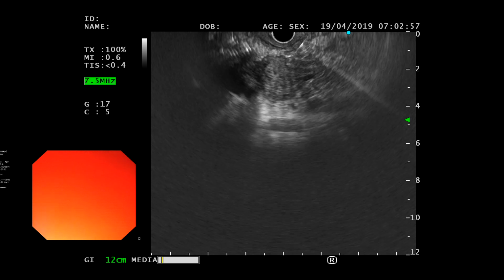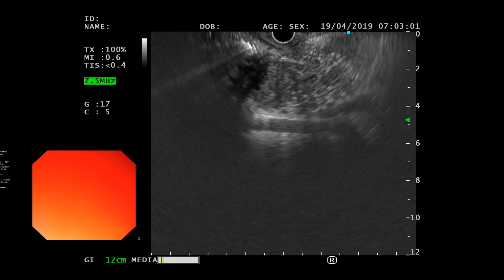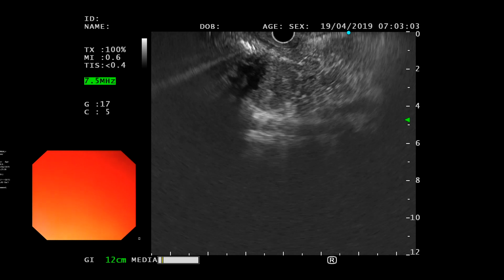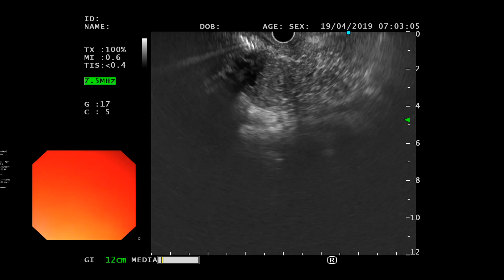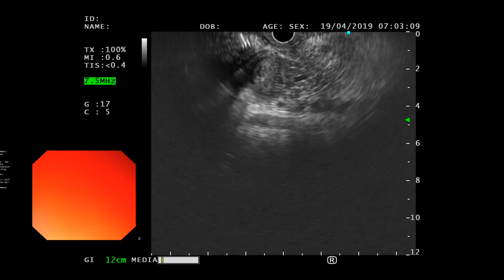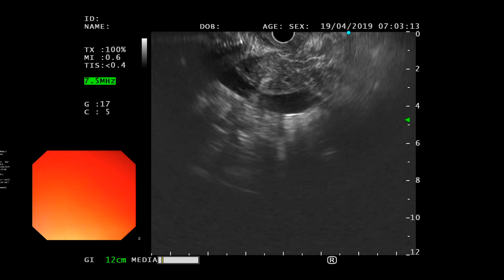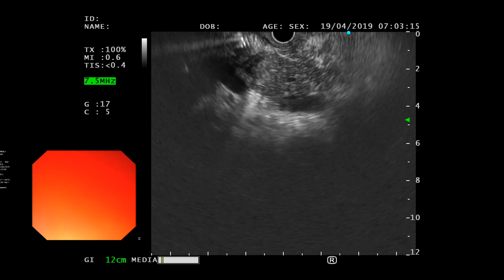This is the last pass. हमेशा इसको लॉक करके निकालो, विदाउट लॉकिंग नहीं. इसको अकेले छोड़ दो जी. आ जाओ, आइए.